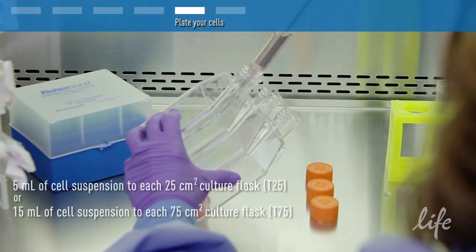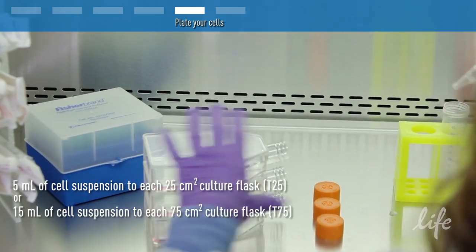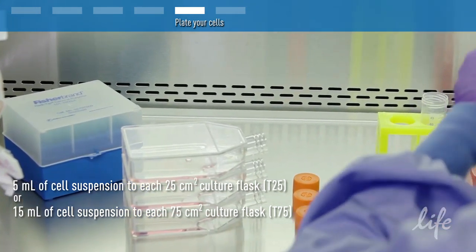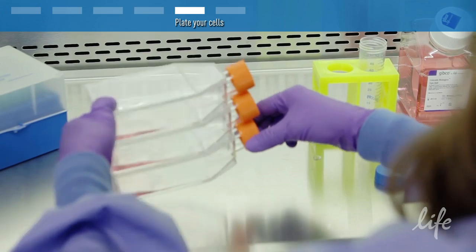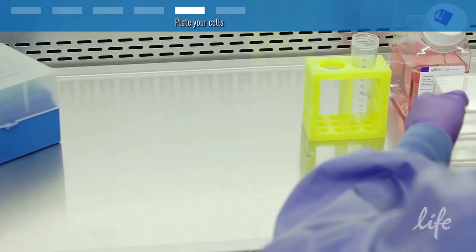When you plate the cells, add your cell suspension to the culture flask. Swirl the medium in the flasks to distribute the cells evenly so they won't grow in uneven patterns.